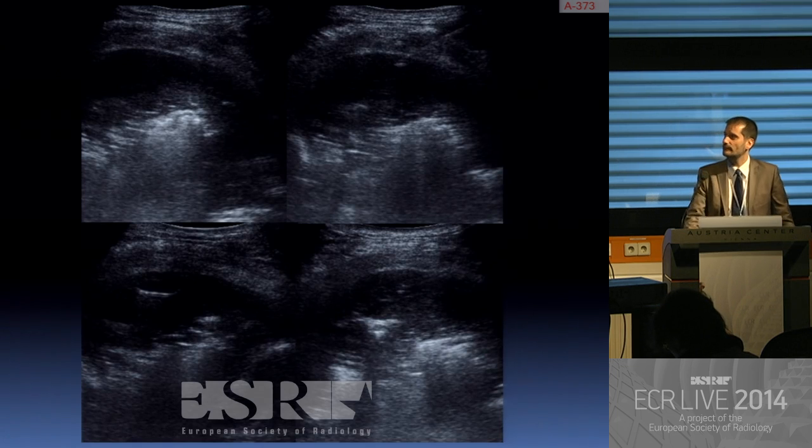Here you have an example of a pleural drainage. Here you can see the needle next to the pleura and how we can administer the anesthetic. Then, using the same approach, we introduce the needle inside the pleural space. Always using ultrasound guidance, we insert the wire, trying to put it in the posterior and inferior aspect of the pleural space. In this image, you can see the small bore catheter inside the pleural space. At this moment, we have started to drain the pleural effusion, and you can see here the re-expansion of the atelectatic lung.